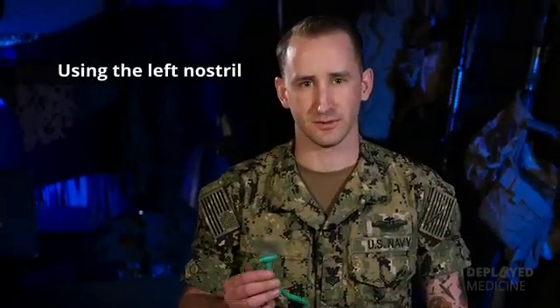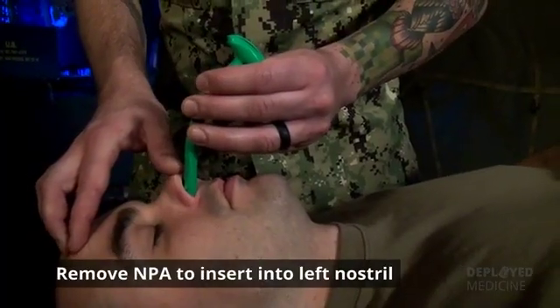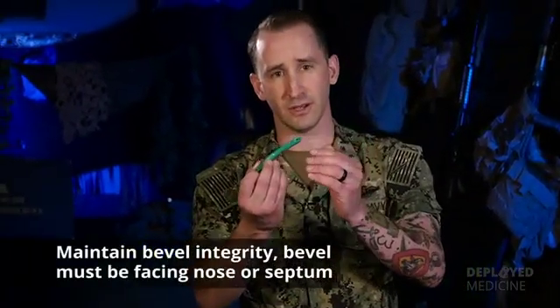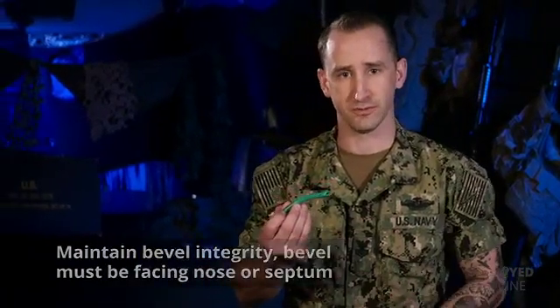If you're unable to get the NPA into the right nostril — whether from resistance or it's just not going in — remove the NPA and insert it into the left nostril. The difference between left and right is that you need to maintain bevel integrity and make sure the bevel is facing towards the septum.